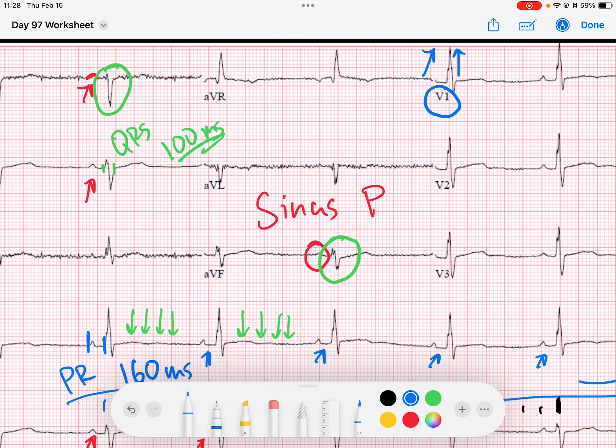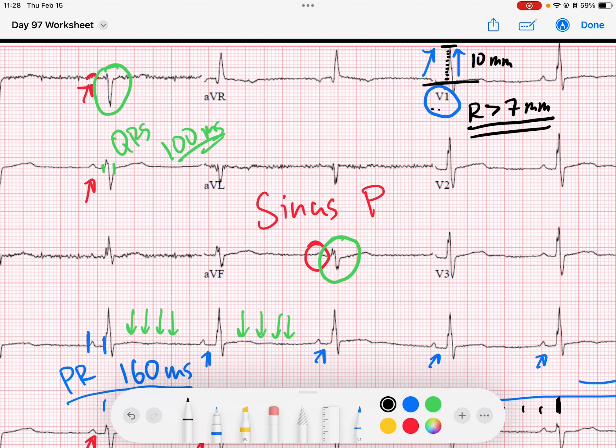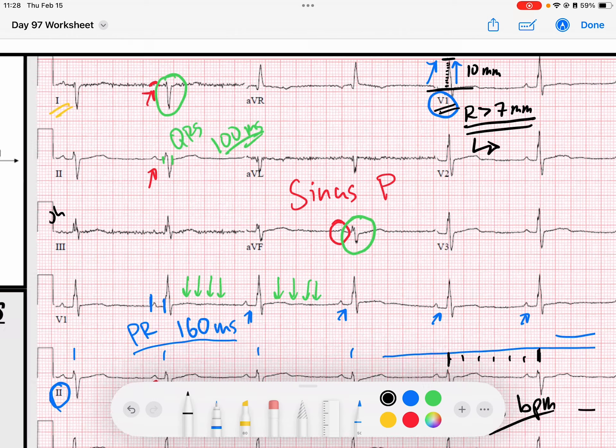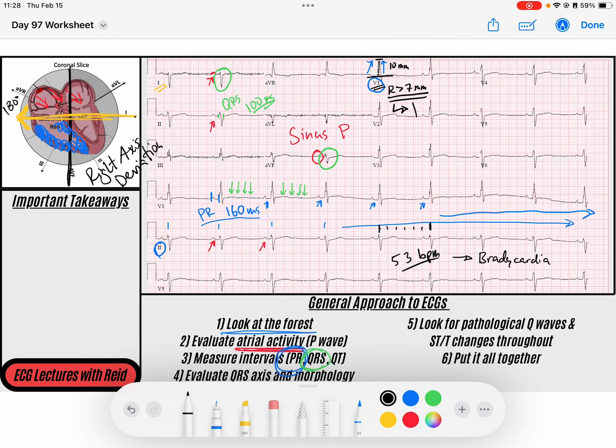In the amplitude of the R wave, if I draw my baseline which is right here, and I see the top of the R wave is right here, that is one, two, three, four, five, six, seven, eight, nine, ten millimeters amplitude. And we know that if the R is greater than seven millimeters in amplitude in these right ventricular leads, V1, then that is criteria for right ventricular hypertrophy.